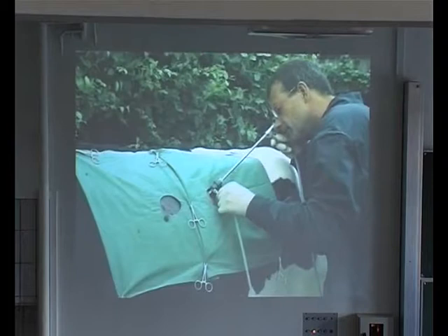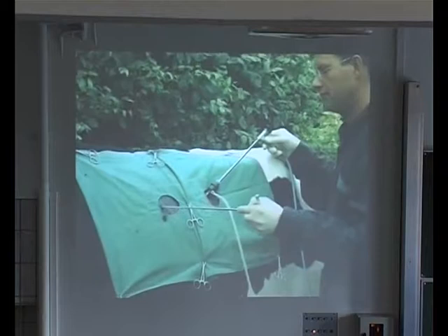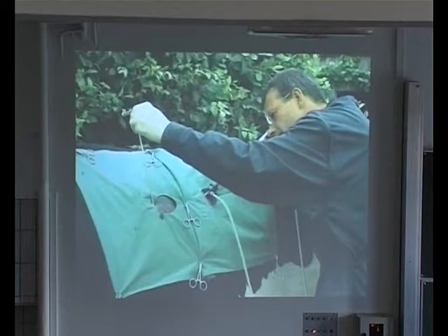We see the surface of the abomasum. Sometimes we have fibrin, and perhaps there are adhesions of the abomasum with the abdominal wall, and we exclude that, and then we can bring in a toggle. Under endoscopic control, we insert this toggle-setting trocar. It's important to do this under endoscopic control, not to hit the spleen. Here you see the spleen, and it bleeds a lot if we puncture the spleen.